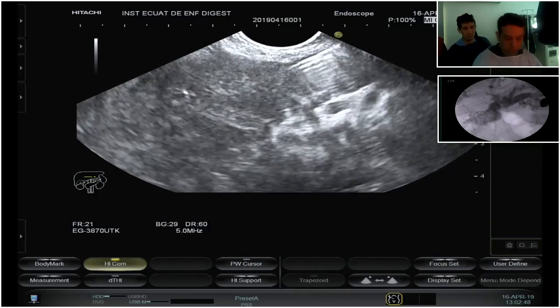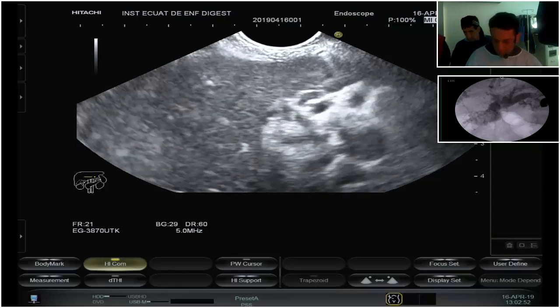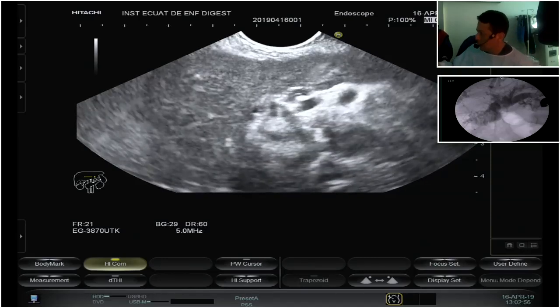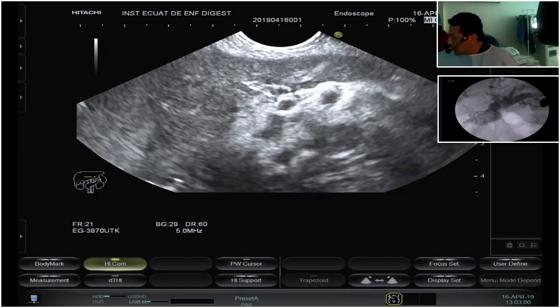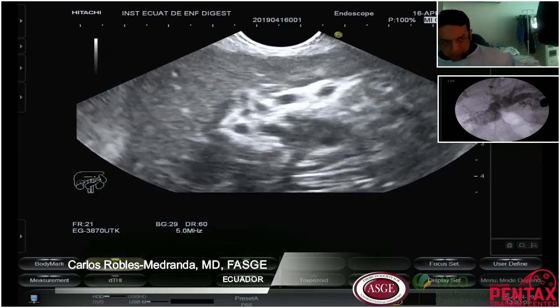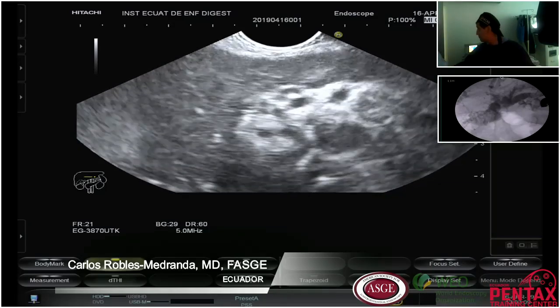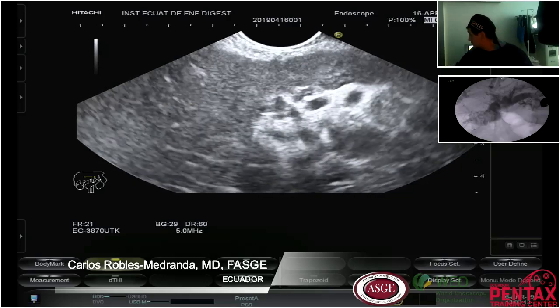So let's go to see what do we have. Okay. Chico, que hay muestra, mira. Aquí hay muestra, mira. Hay que recogerlo. ¿Puedes tener aquí? Can you just take here? A ver, perdón, un segundo. No, no hagas nada. No. Calma. Ven acá.